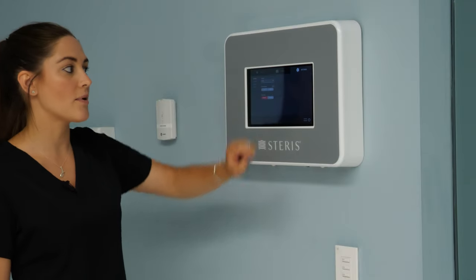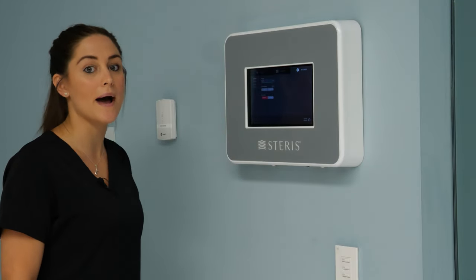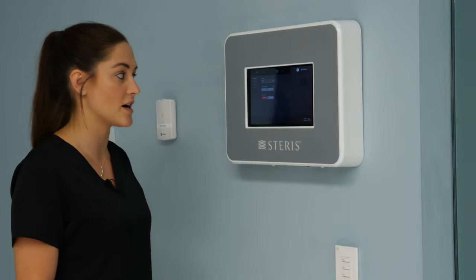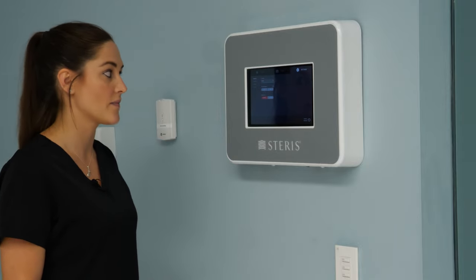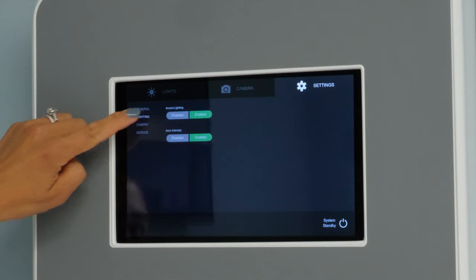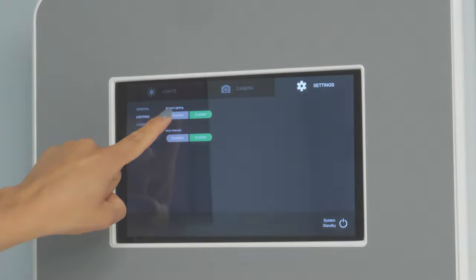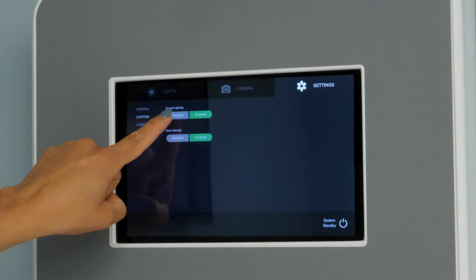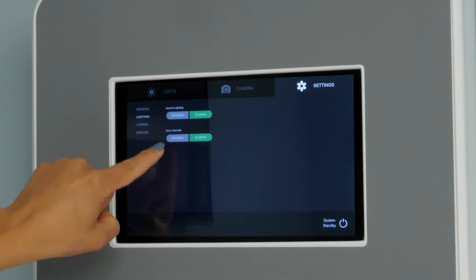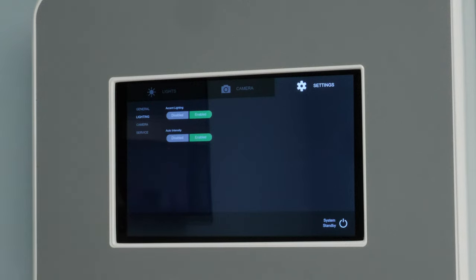The third tab across the top is going to primarily be used by Biomed, Clinical Engineering, and Steris service. The one tab you might use is the second one down, lighting. There are two key features to the Steris system called an accent light and auto intensity. On this screen you would either disable or enable the lights, and we'll go over those features when we review the light head.